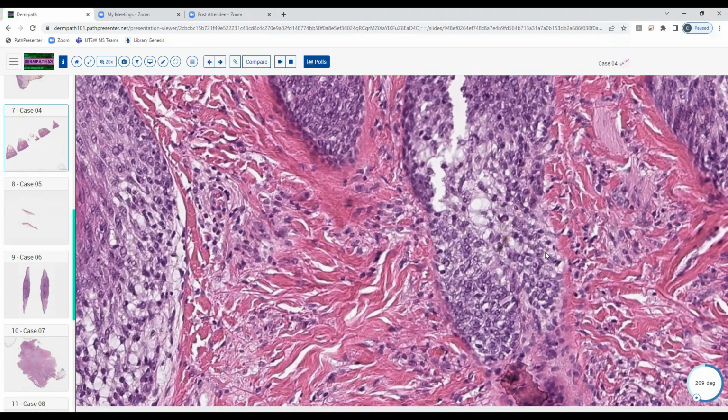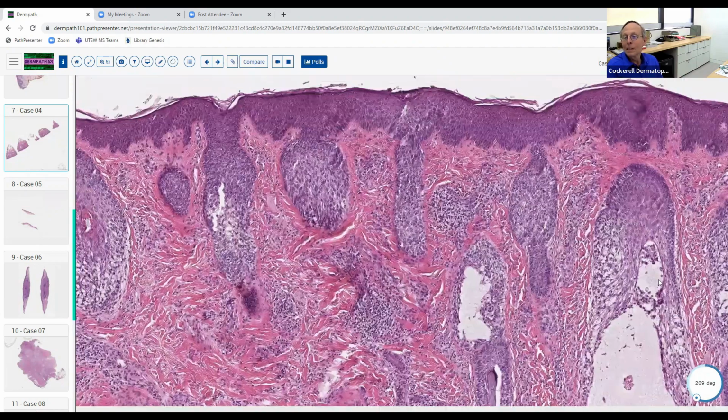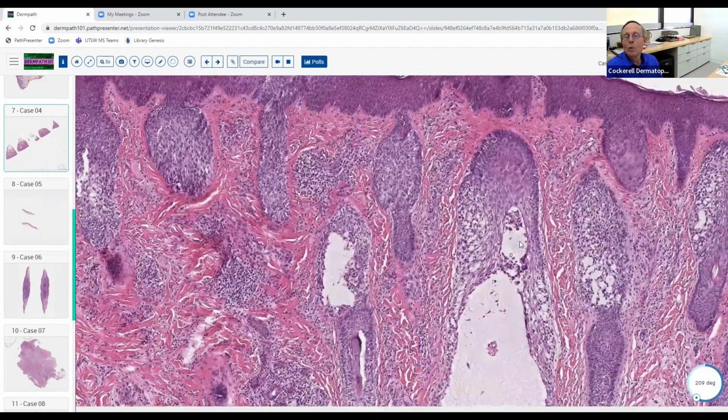I guess you'd want to make sure there aren't any other secondary causes of a follicular plug, like infection, folliculitis. Yeah, but if you just saw this without knowing that this was mucin, doesn't it kind of look like spongiosis also? Yeah. And so follicular spongiosis is sometimes in the differential diagnosis of follicular mucinosis. Now, obviously we can quickly rule that out here.